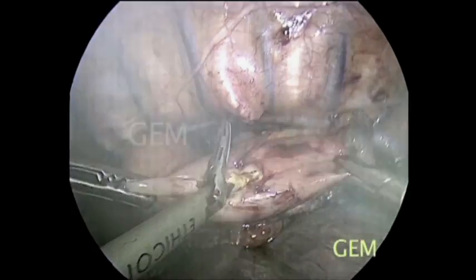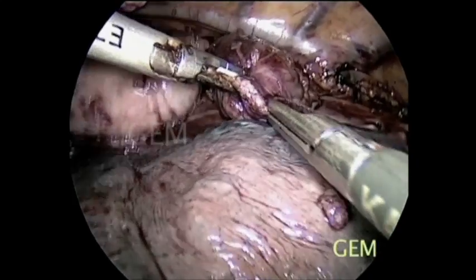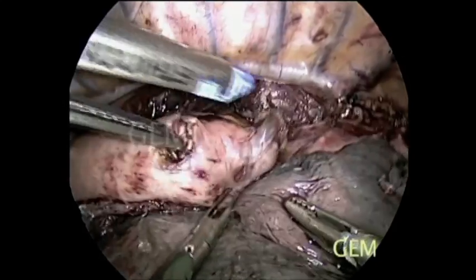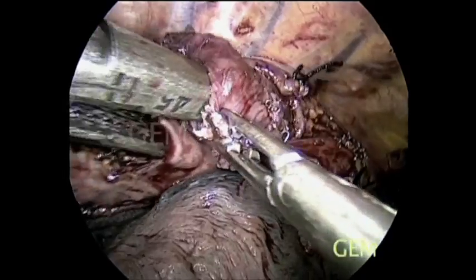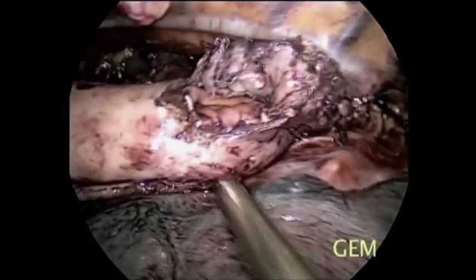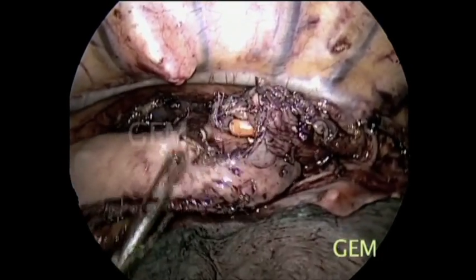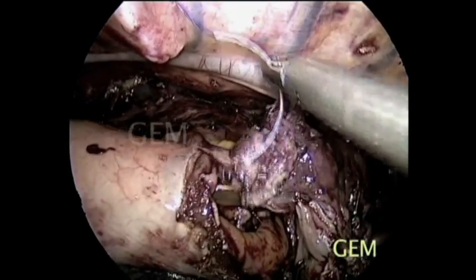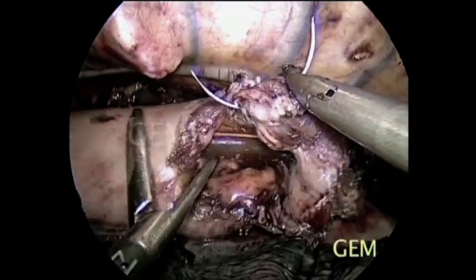Now I will show a staple-assisted technique, which I have been using previously. I make a small cut at the staple line of the proximal esophagus on the alternate side — this is a side-to-side staple using a 4.5 cm blue cartridge. The advantage of this anastomosis is an oblique stoma, so stricture or leak is rare. Adequate blood supply is essential; if not present, end-to-end anastomosis is preferred.